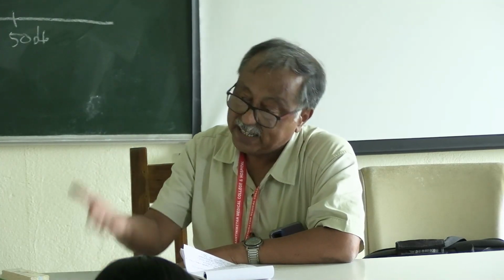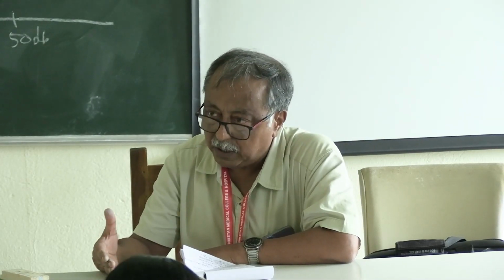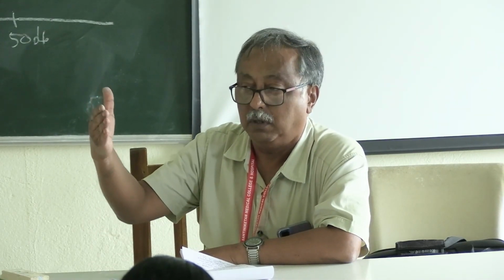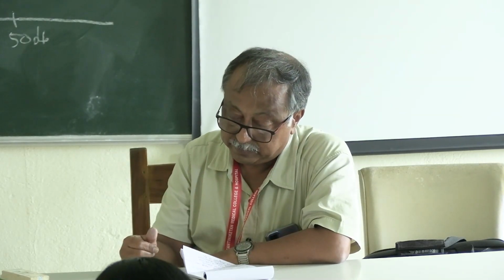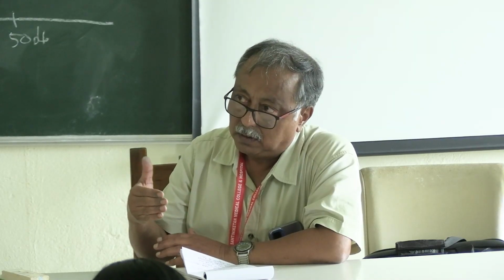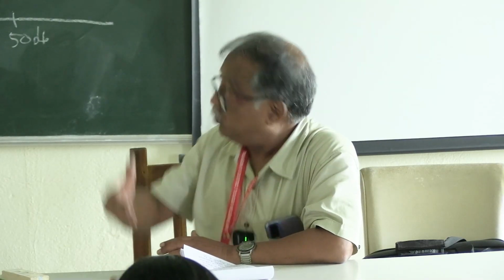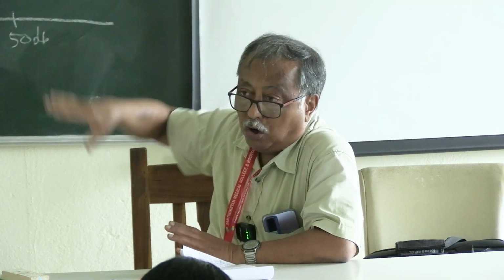Begin with 20 decibel above the threshold in the normal ear and in the affected ear. If there is a 30 decibel loss in the affected ear, you start with 50 decibel, but in the normal ear we start with 20 decibel. Increment of the loudness is 10 decibel in each step, and it will increase up to the level where it matches the normal curve or the end of the audiometry machine.